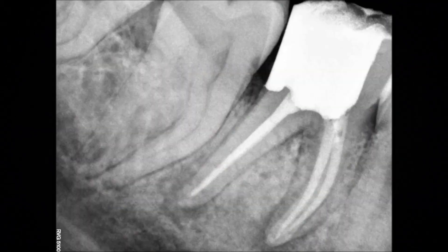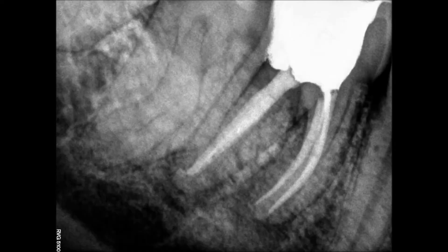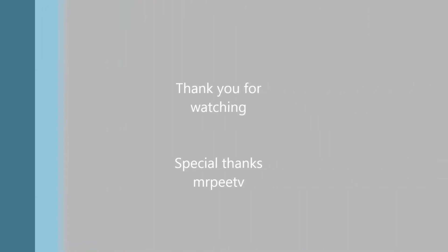The next clip shows clearly the application of pre-heated gutta-percha into the distal canal, filling out that oval space quite nicely — it's just much better than it would have been with a cold technique. After final caries removal, we built the core and referred back for the crown. Cuspal coverage is critical; the tooth will not survive without it.